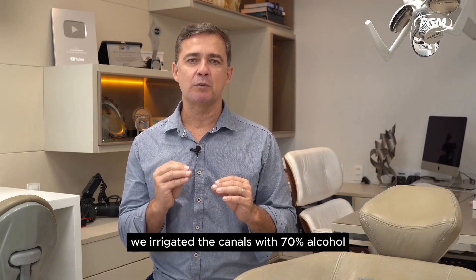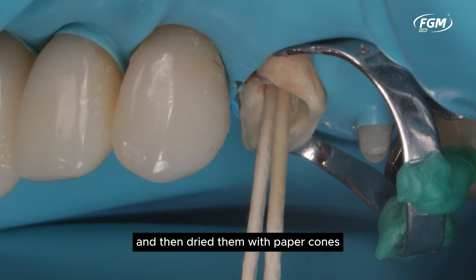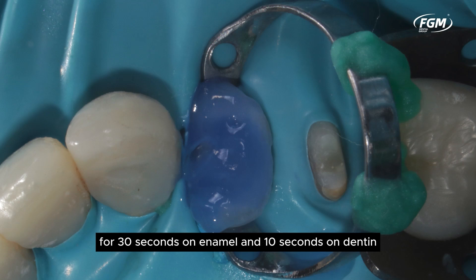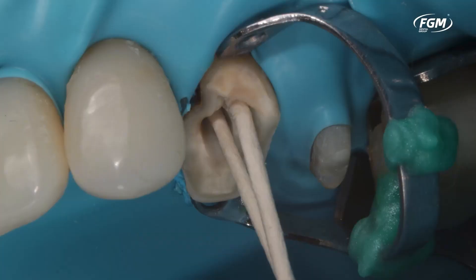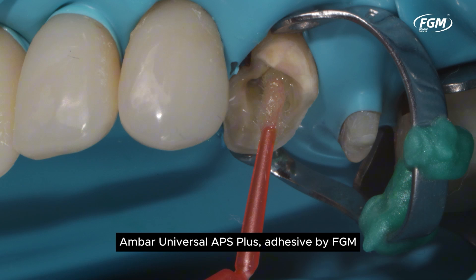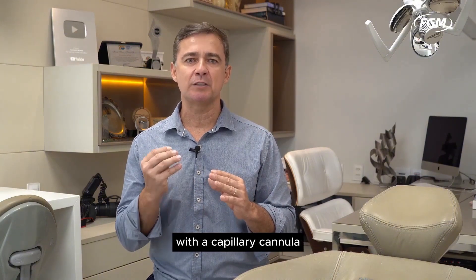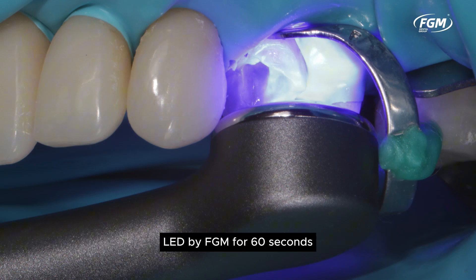Before cementation, we irrigated the canals with 70% alcohol and then dried them with paper cones. For the adhesive procedure, we conditioned with 37% phosphoric acid for 30 seconds on enamel and 10 seconds on dentin, followed by abundant water rinsing and drying with paper cones. The Ambar Universal APS Plus adhesive by FGM was applied with the extra fine cavi brush. After removing the excess adhesive with a capillary cannula, we photopolymerized with the Quasarocket multi-wave LED by FGM for 60 seconds.